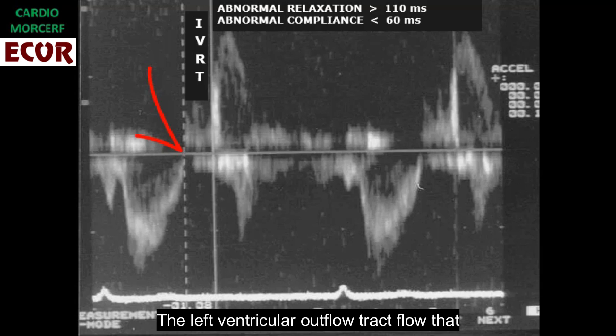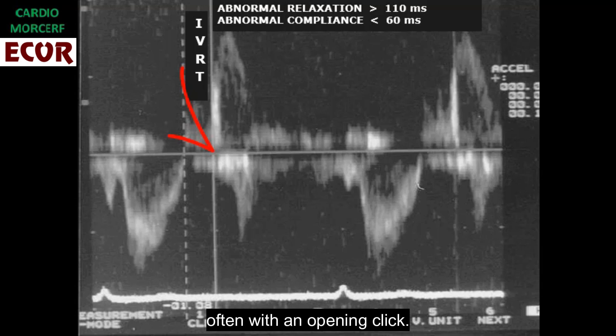Here the left ventricular outflow tract flow that finished precisely at this point, and here the mitral flow that starts at this point, often with an opening click. Then we can evaluate the isovolumic relaxation time from the closing of the aortic valve until the opening of the mitral valve.